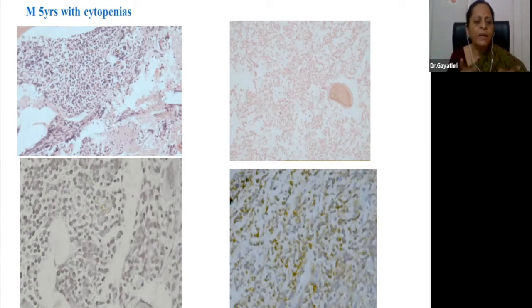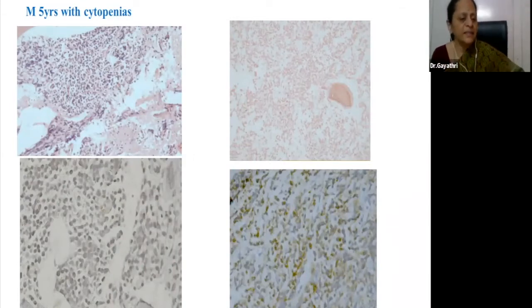In your lab, whether you do cytology, histopathology, or hematopathology, you should have a myeloperoxidase, because that can help you sift the myeloid from the rest, and definitely identify the myeloid leukemias. So myeloperoxidase stain, esterase is of course preferable and should be done. Okay. So that was for the cytologic morphology of abnormal cells.